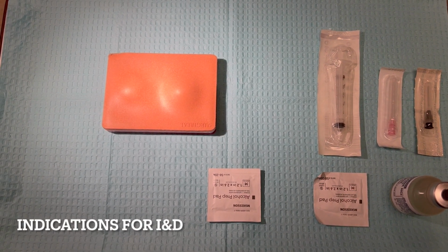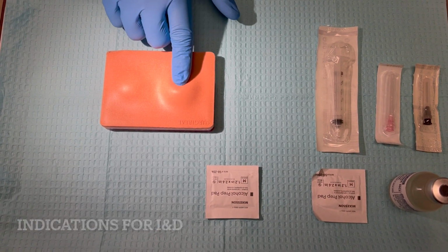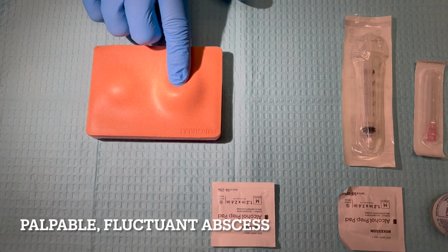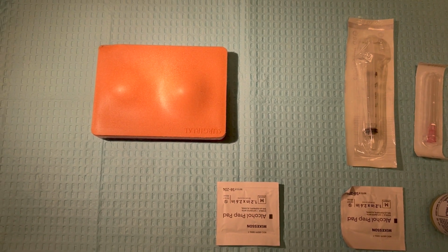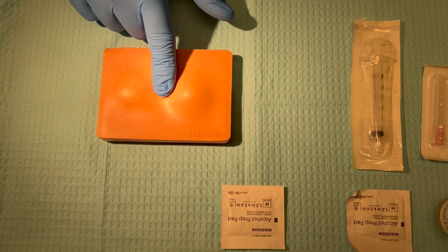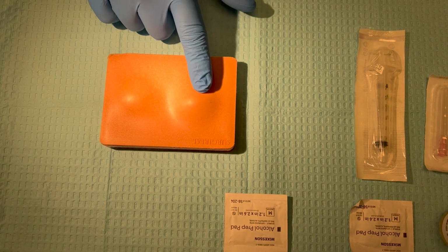The main indication for abscess incision and drainage is if we have a palpable, fluctuant abscess. Hopefully you can see it's very boggy, fluid-filled. I frequently will refer to this as a water balloon under the skin versus an indurated area. Again, when I don't have a good representation, when you push on it, it's more firm. It may be raised, but it will not have that boggy appearance to it.